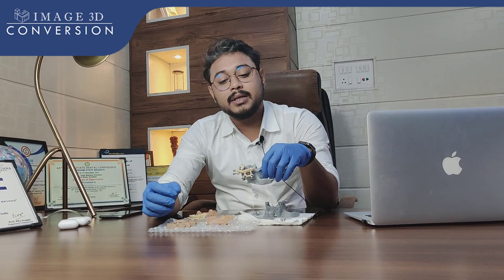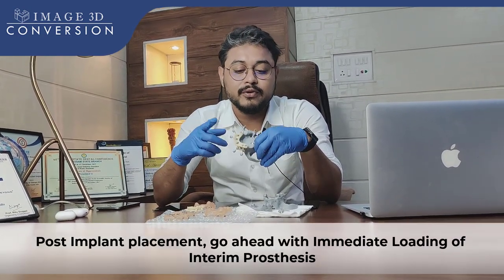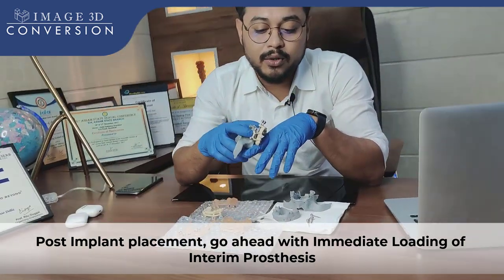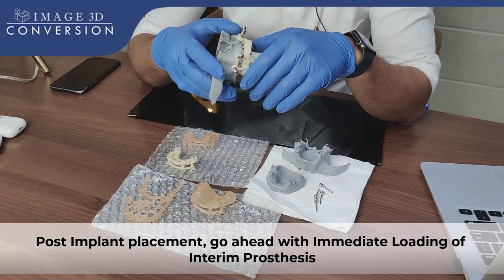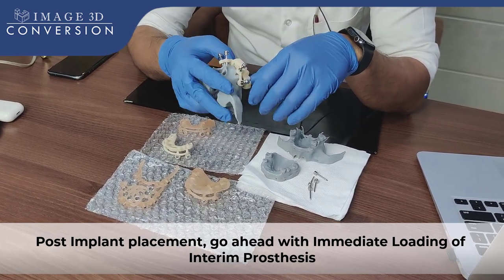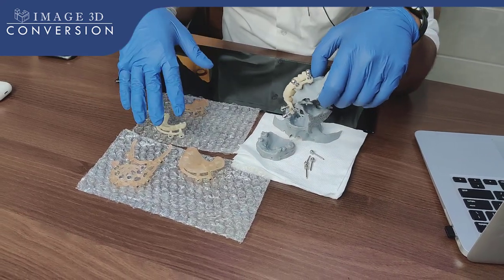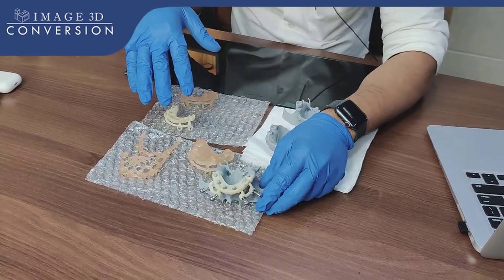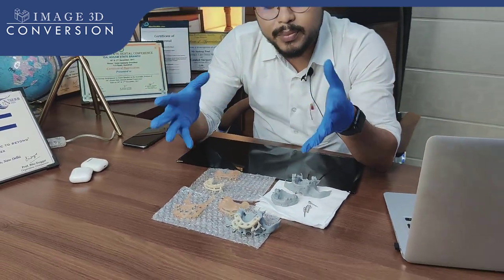After implant placement, most of the guided surgery we follow with guided surgery for immediate loading, to make the full arch surgery most precise and most efficient. So just let me explain what things we have fabricated — what we always prepare before going for guided surgery for full arch complicated cases.